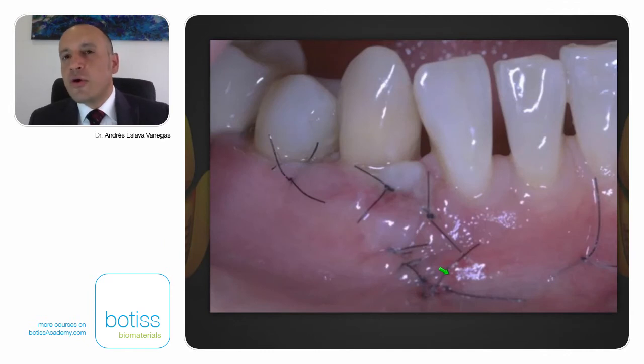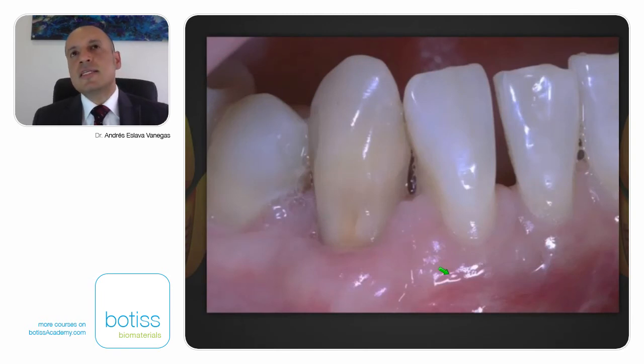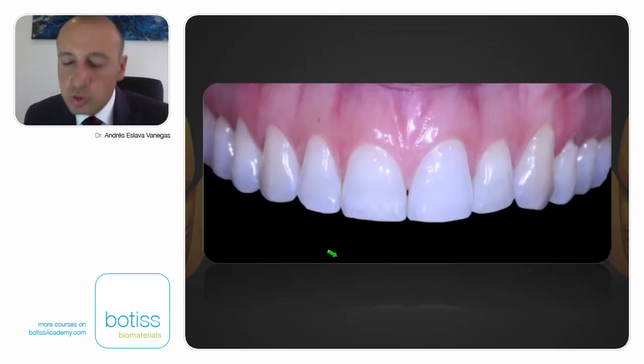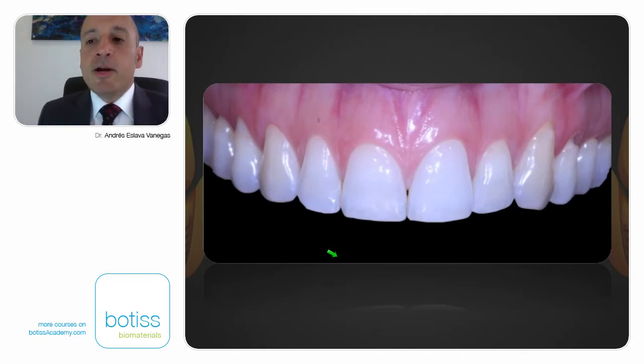This is 24 hours after the surgery, and you can see the recovery of this. And now we have more experience, and you can see how it heals. This is 2 years after the surgery, and you can see what the cover of this root surface was. And it is almost impossible to see a scar in this area or in this tissue. Okay? And look at the biotype. It's really good. Can you get that with connective tissue grafts? Maybe, but not always.